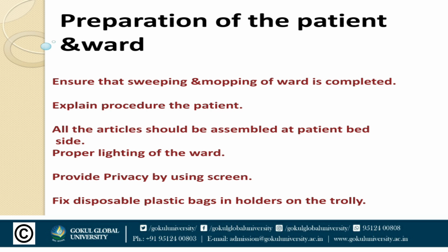After that, explain the procedure to the patients. It will help to reduce the anxiety of patients. Make sure that all articles are near the patient's bedside. After that, ensure proper lighting of the ward and provide privacy by using the screen. After that, fix disposable plastic bags in the holders on the trolley. It will help to discard the dressing material. These are the preparations for the patients as well as the ward.